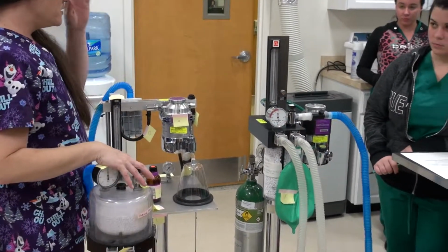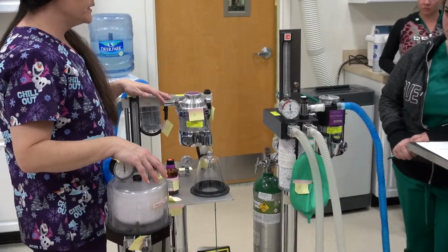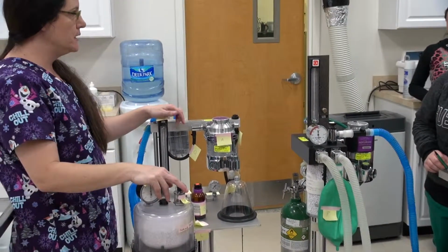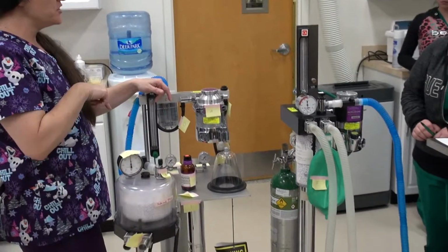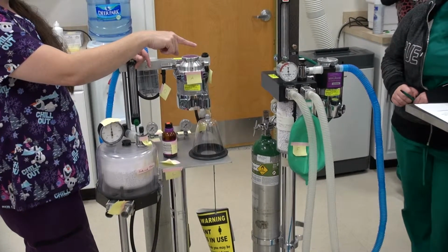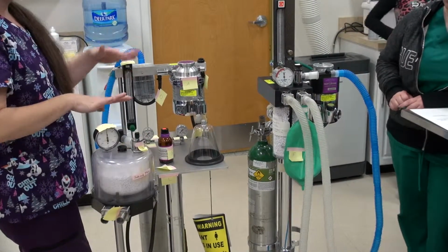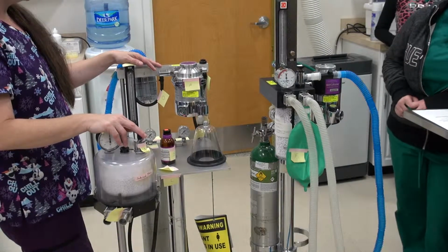So what I would suggest, we're going to wrap up in a couple minutes. I'm going to let you go a little bit early today, but if you haven't intubated that dog, you need to do that today a couple times. And I would review the machines because I might not necessarily use this machine. I could be using this machine on the practical, okay? So it could be either or. So you need to know it inside out no matter what type of machine it is. You need to know where, A to B and B to C, okay?